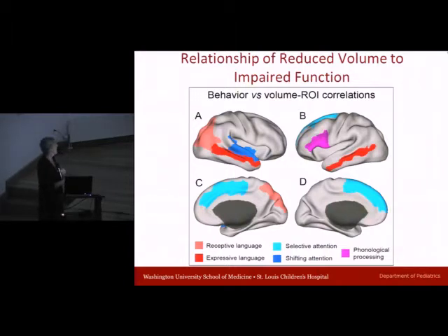So to really be able to get at these higher cognitive processing functions, we're going to need more than just looking at the conventional imaging of white matter abnormalities to really be able to capture the complex tasks that are here. But it does appear that the white matter abnormalities may be a reasonable biomarker.